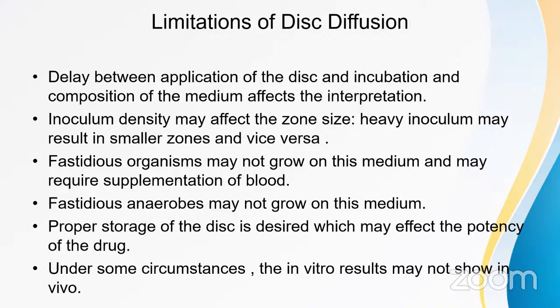A fastidious organism may not grow on this medium, so it may require supplementation with blood. Proper storage of discs is important, as it may affect the potency of the drug. Under some circumstances, in vitro results may not show in vivo.